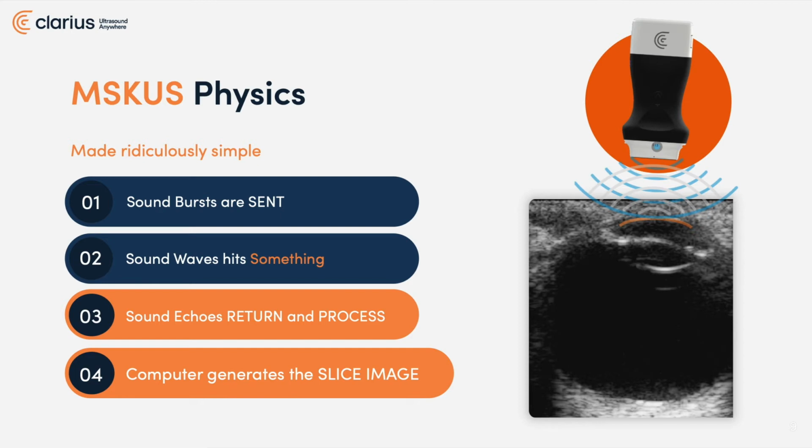This particular image is the third image I ever took with a musculoskeletal ultrasound device. It was of my 10-year-old son's eyeball. We were actually at a retreat at a medical conference, and he came into our cabin, and I simply said, "Hold still," and I put gel on his face and put this right up to his eyeball, and that orange line represents his cornea. And this little football-shaped item is the lens, and the vitreous humor behind his eyeball is this dark anechoic region, and I'll tell you, I was hooked.